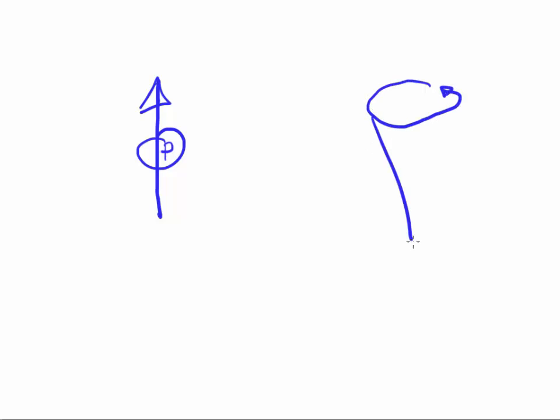An interesting thing happens inside the magnet. Besides lining themselves up with the field, these protons can have a wobble. Now again, we said that the magnetic field keeps them aligned. But if you've noticed with a gyroscope or a top, for instance, they might have a little bit of a wobble, especially with a gyroscope. This wobble about an axis is called precession. The tip of the gyroscope will wobble in a circle.